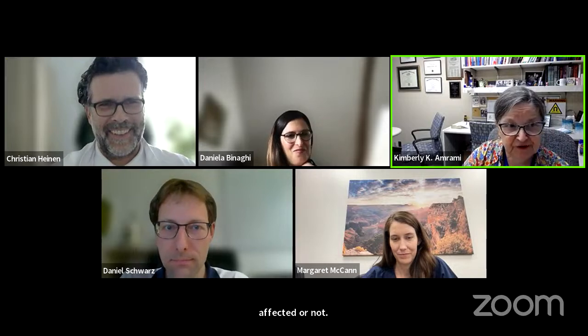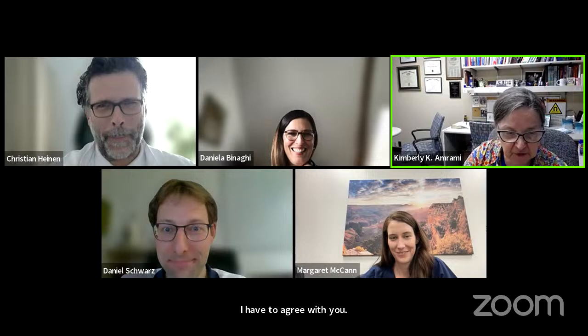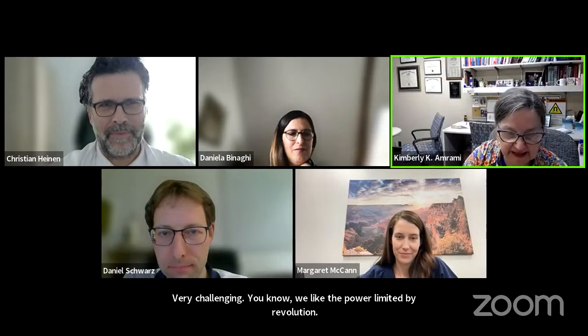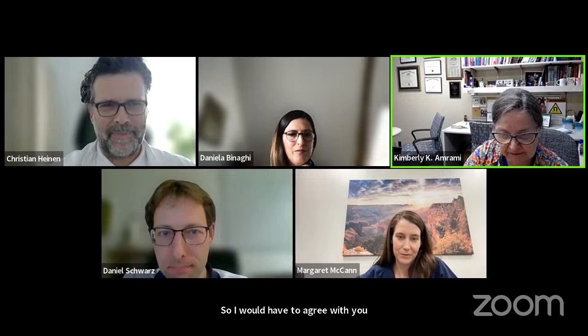I have to agree with you. I think it's challenging, very challenging. We're limited by resolution, we're limited by how things blend into the background. So I would have to agree with you. And again, that might be an instance where ultrasound's super helpful.